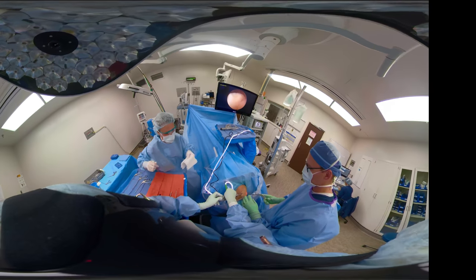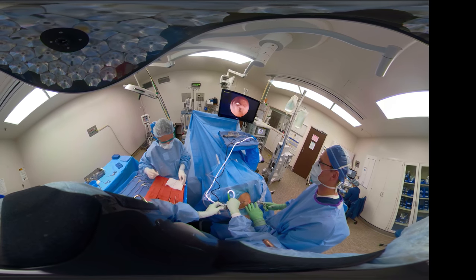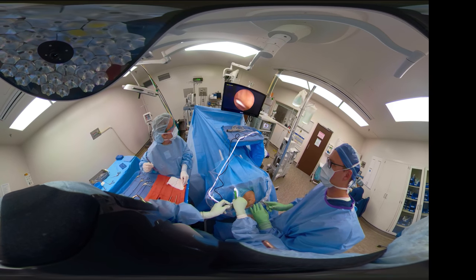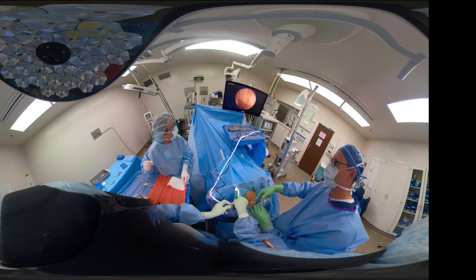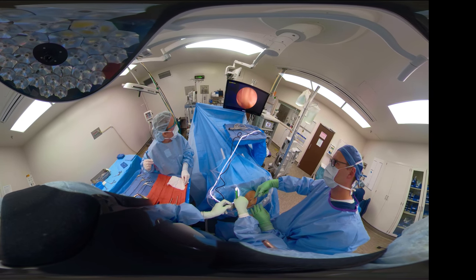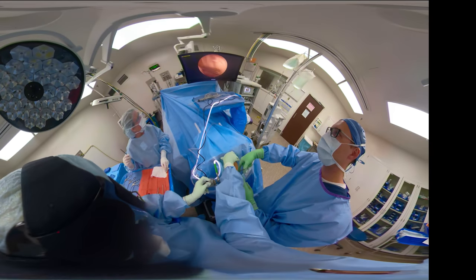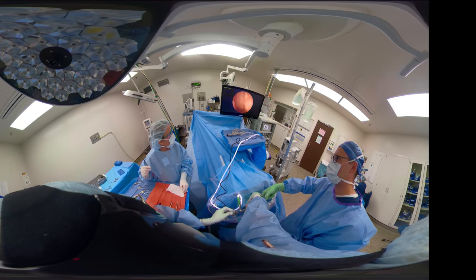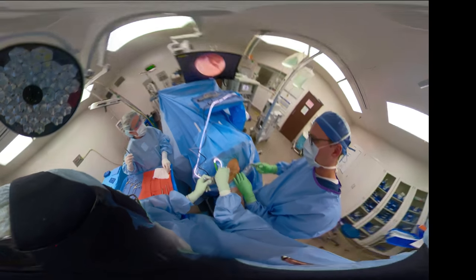So he has now removed the loose body, part of it. There's still part of it that's in there, so we have to keep our eye on that loose body and not lose what is remaining. So we got about half of it out, and then open the jaws big and wide. The person driving the scope needs to keep the eye on the ball, so to speak, so you can see it. And then we'll get more of this loose body out.